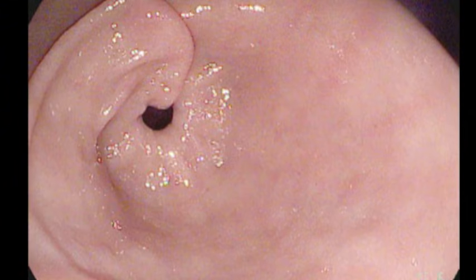Here is a clear view of the pyloric sphincter, the entrance into the duodenum. Here the muscularis externa transitions back to its typical bilayered structure. The sphincter itself is an anatomical thickening of the inner circular layer and is the dividing point between the stomach and the small intestine.